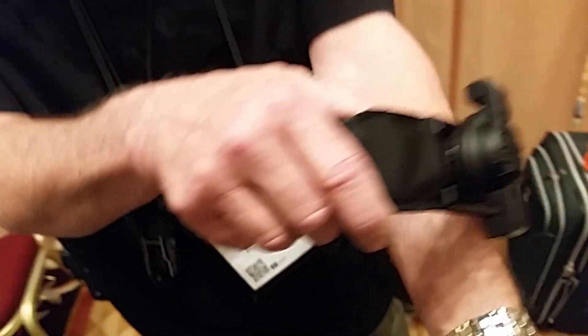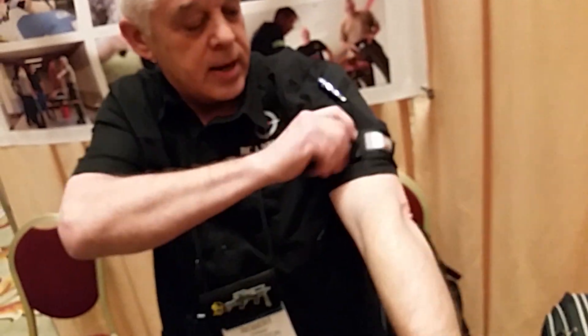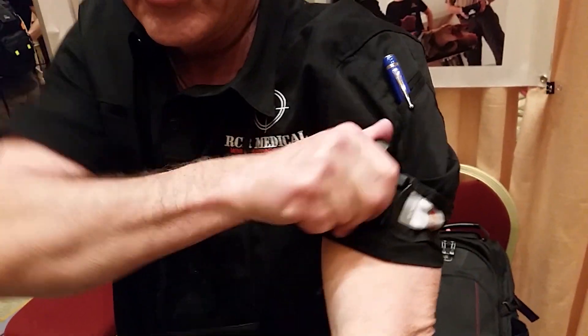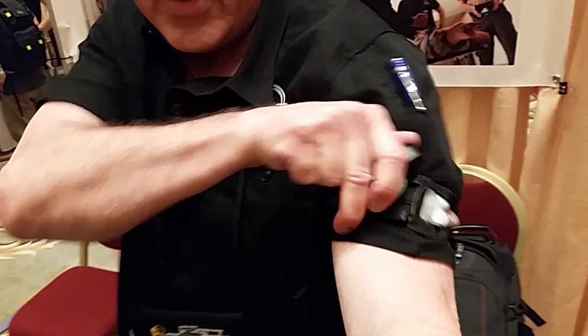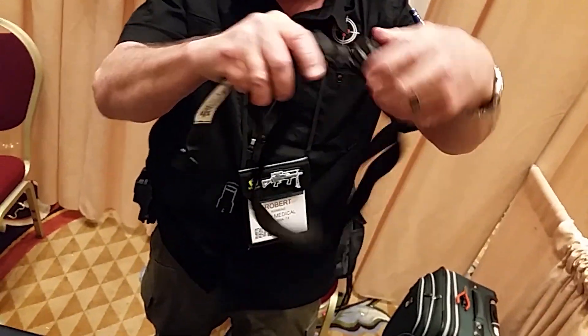So this device, if you put it on your arm or leg, you give it a quick pulse, and then you just twist until you get the blood stop — and that's it. It's about a five-second application. To release it, just snap it here, take it off, and slide that little guy back down if you're resetting it.